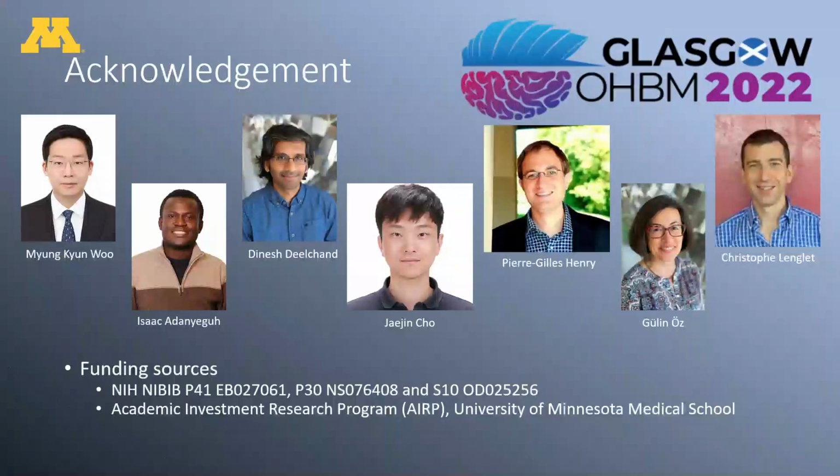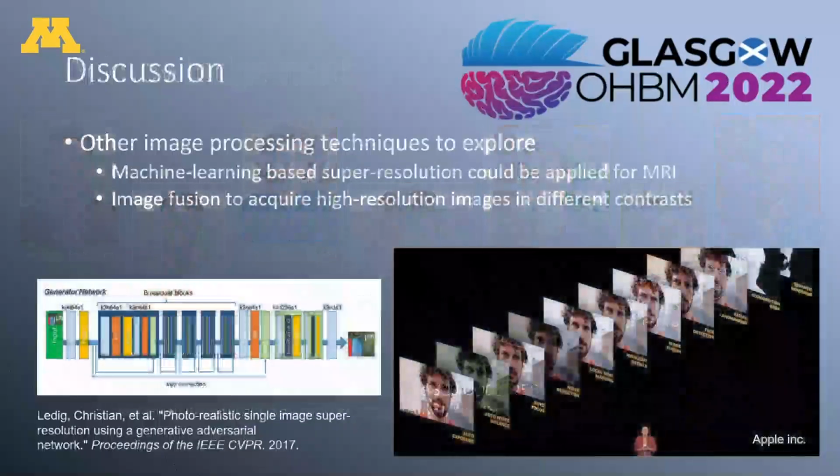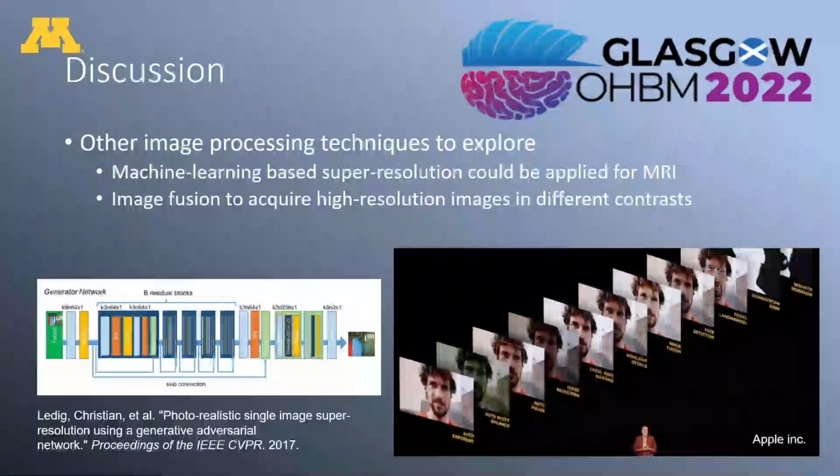Yeah, the one potential advantage I see of this is that in k-space, if you collect at different times, there's different amplitude modulation in k-space that you have to correct for, and here you don't. But it still seems that keeping it in k-space is ultimately better if you can correct for that. Still, this is nice and straightforward and practical. And I think that's one of the reasons why I put the last slide, because with getting multiple frames, you can think about getting maybe a low-resolution contrast, and then high resolution, like the outer edges of k-space. So it's something that I'm thinking about.